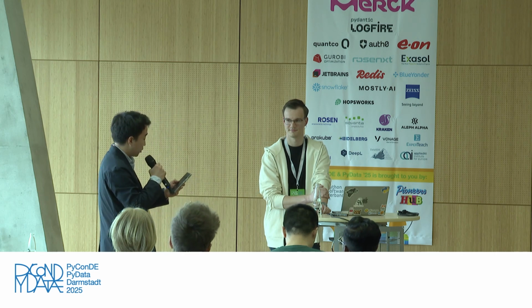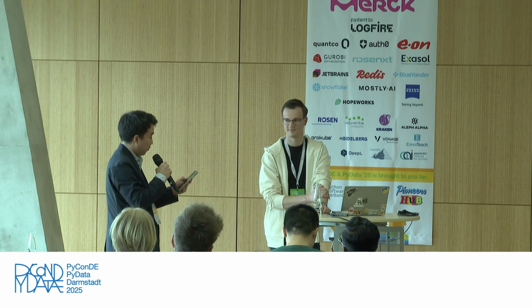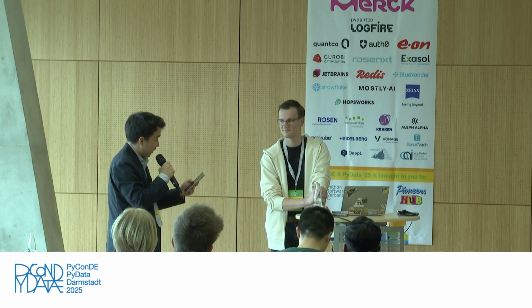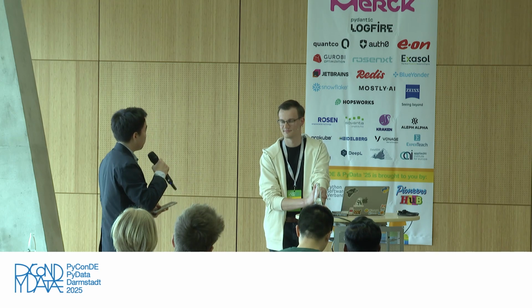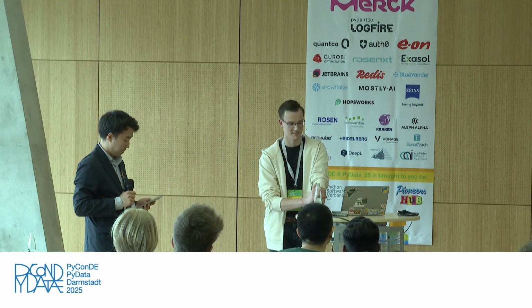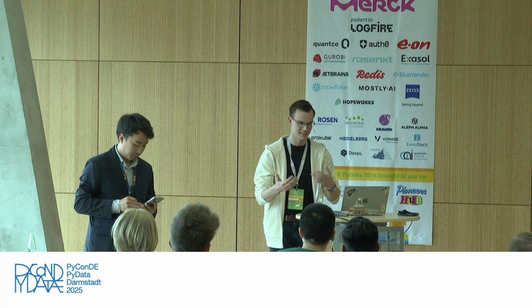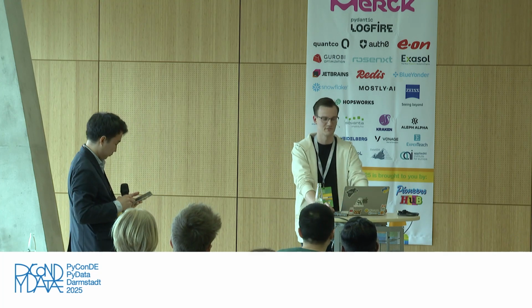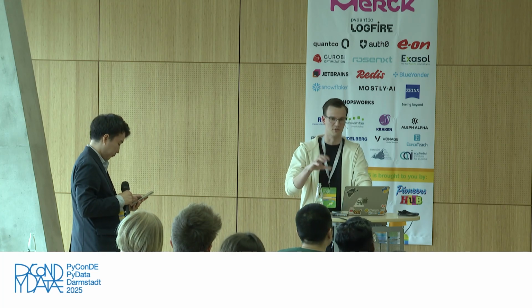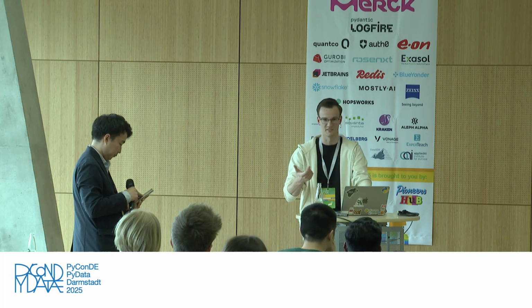First question: does the fact that stain color depends on who did it, and maybe which hospital did it, introduce bias? Can the model use it as a shortcut for prediction? Actually, it introduces a heavy bias, and as we are quite lazy and pathologists don't talk to each other, we have many models which only work on their own data, and if you apply them to new data, it doesn't work at all.